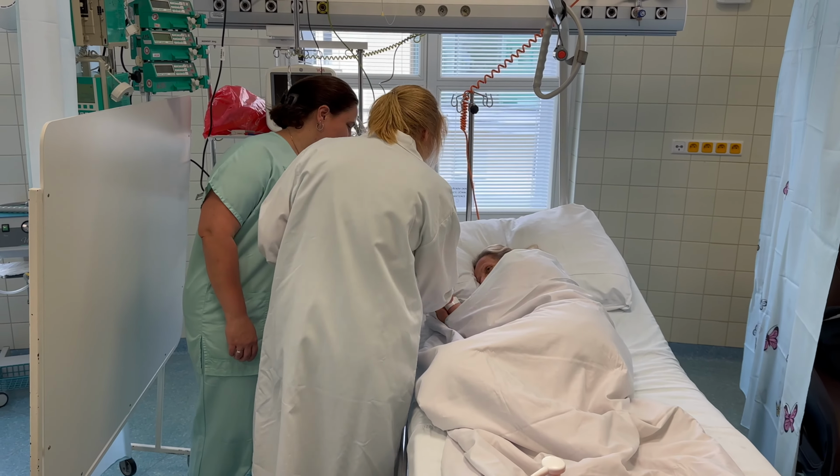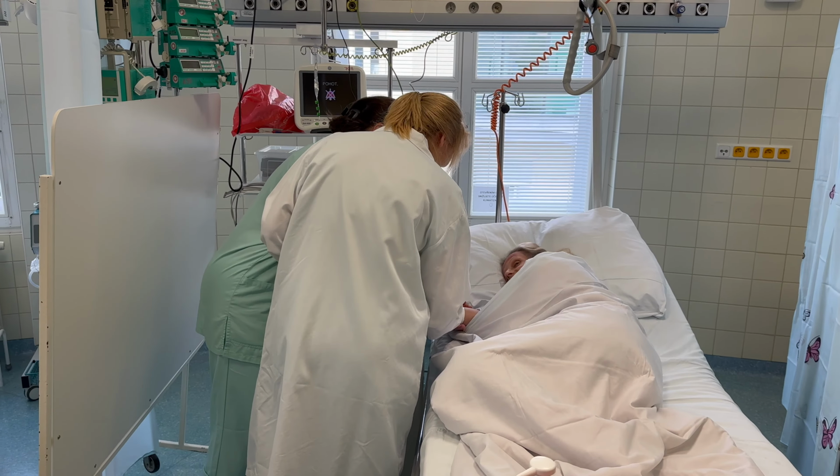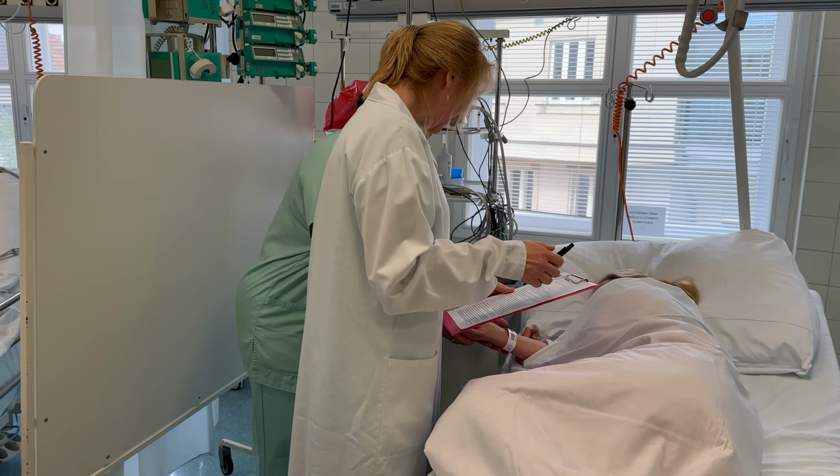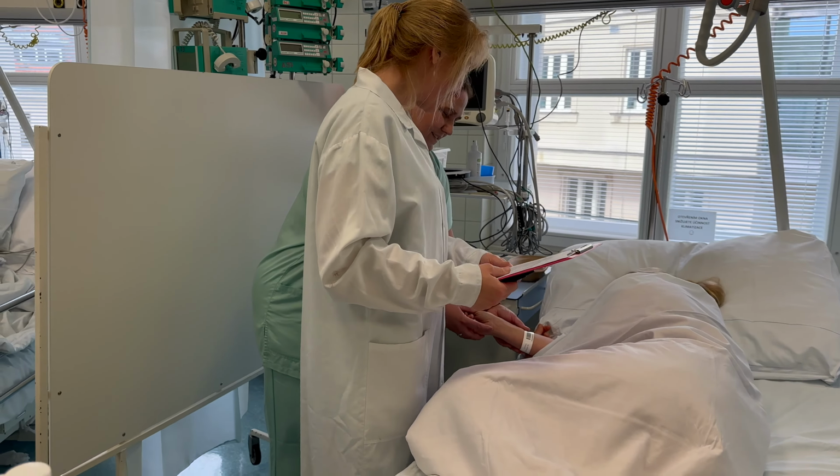The physician must inform the patient of the planned procedure and obtain a signed informed consent. After obtaining consent, request forms and blood collection tubes are prepared.